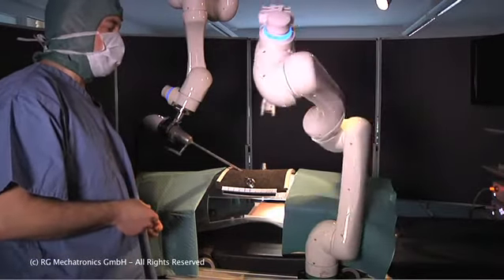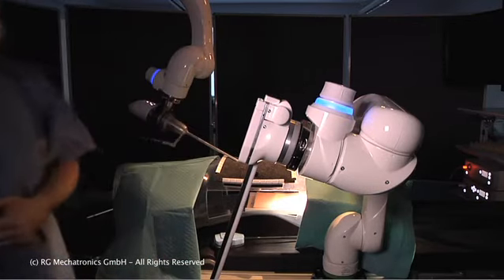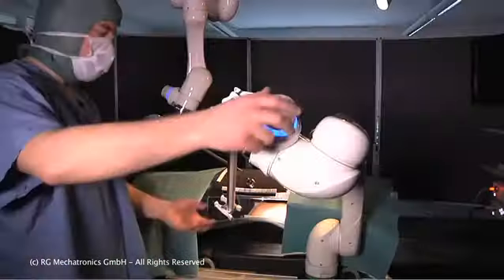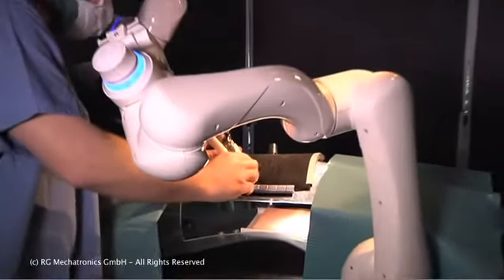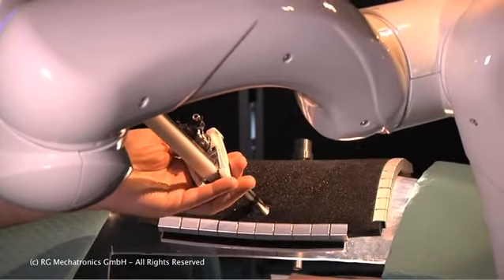The assistant performs a motion test of the instrument holder. And now the robot can be attached to the trocar. It's driven into position with the RoboCommander, and now the trocar is clipped into the trocar holder. The position of the trocar can be adjusted slightly.